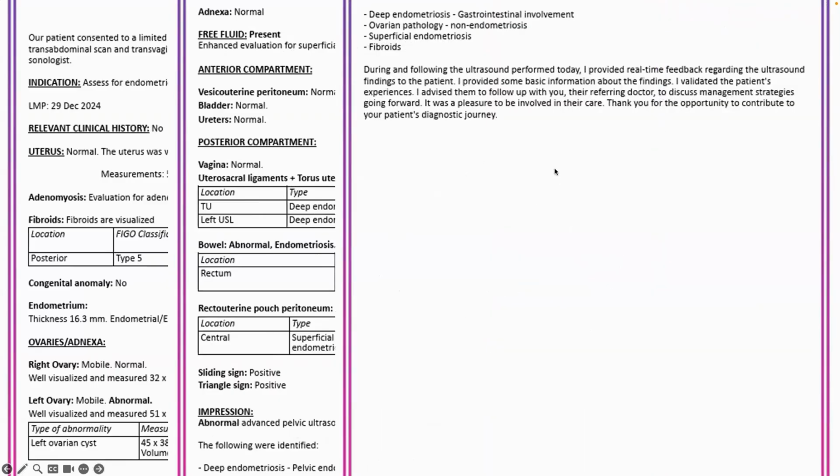identified. Now, in the context of me performing these ultrasounds, a sonologist-led ultrasound, I do provide feedback in real time to patients, but of course that's going to need to be customized based on the setting. This does not happen when we're doing regular gynecologic or endometriosis ultrasound performed by the sonographers. And in those cases, the patients don't get real-time feedback. But that's just a glimpse of what it can look like. And the supplemental material in the practice statement is guided by my day-to-day practice in terms of the practicality and the relevance for a surgical gynecologist audience.